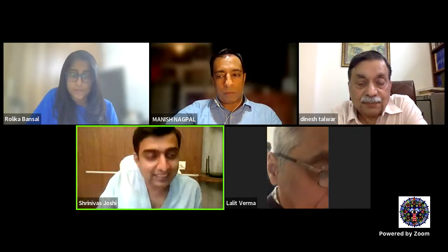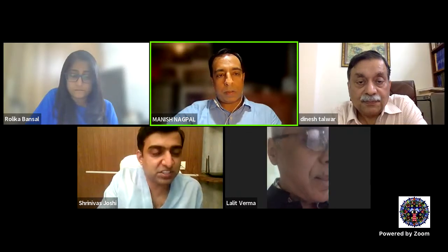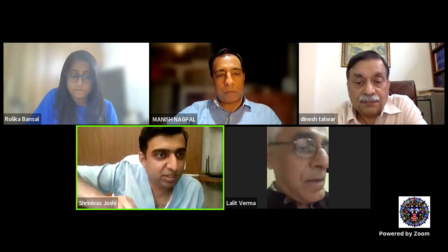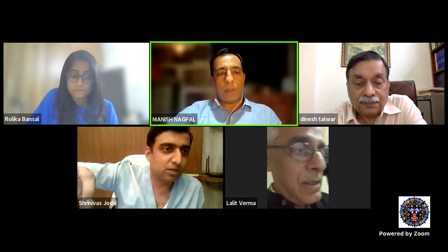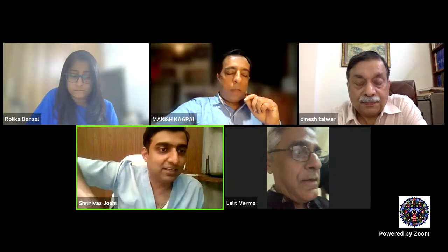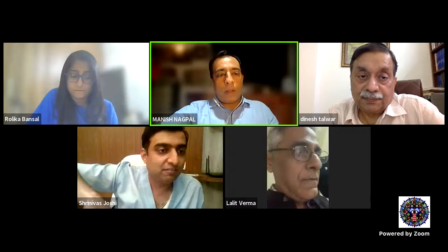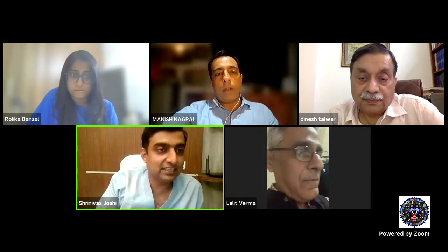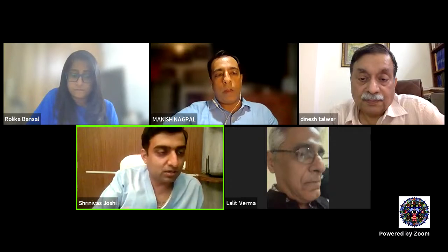See, when you showed that extensive PVR video, in some cases we have a rim of vitreous still left, beyond which you are not able to induce the PVD. Of course, you have induced it up to the periphery, and then that rim remains. It usually happens. Yeah, I know what you mean. A concentric kind of rim, which we can only try to trim. And the more we try to extend it with the forceps or the cutter, definitely the retina is going to tear. So when you notice it on the table, do you convert it on the table?